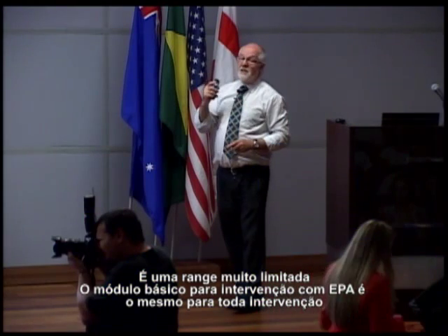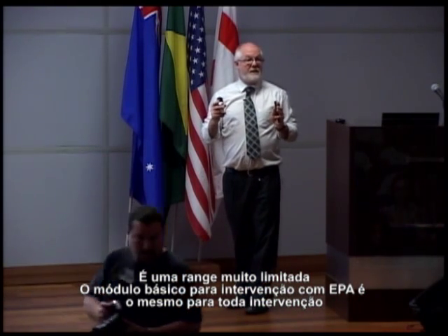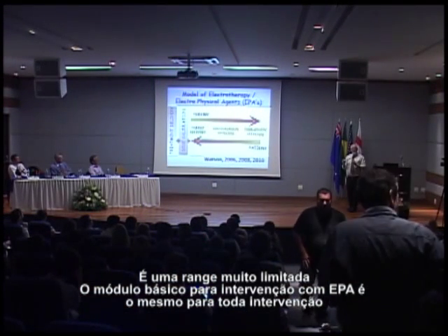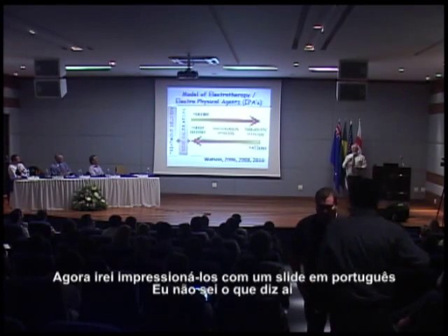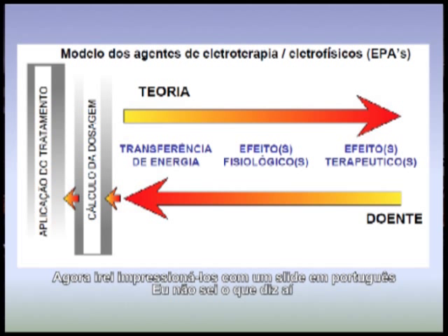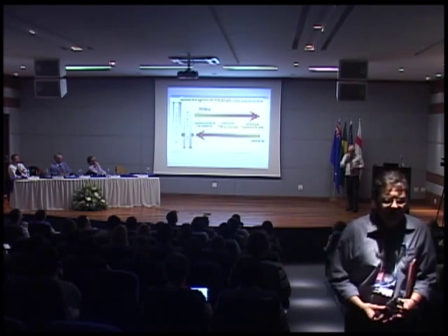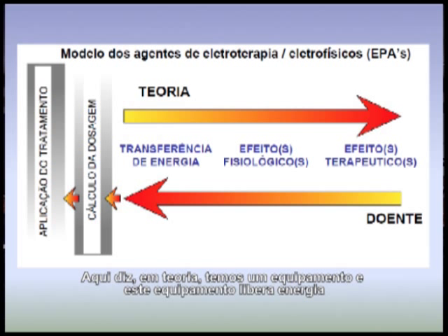So the basic model for EPA intervention is the same for every intervention. So now I'll impress you with the Portuguese slide. I don't know what it says, all right? So it says, in theory, we have a machine, and the machine delivers energy.